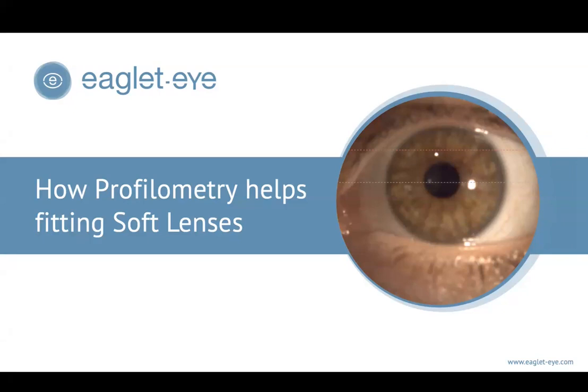In fact, there are studies that have come out looking at the sagittal height of all of our commercially available lenses. There are some patients we've had in the clinic that for whatever reason are not comfortable in a certain lens. When we go back and compare the ESP sag at that lens chord versus the actual sag of the lens, if there's a mismatch, that can affect overall success and comfort with the lens.